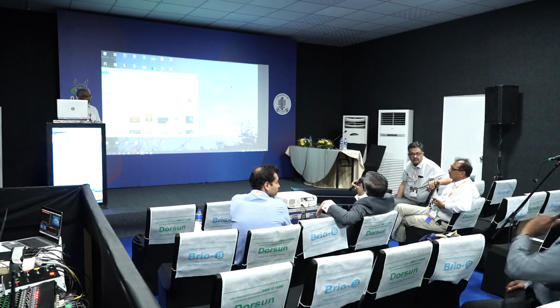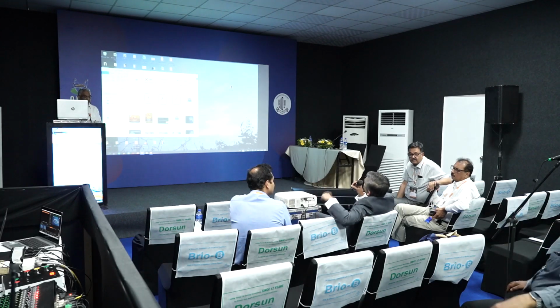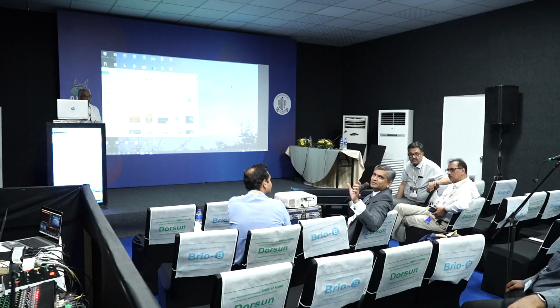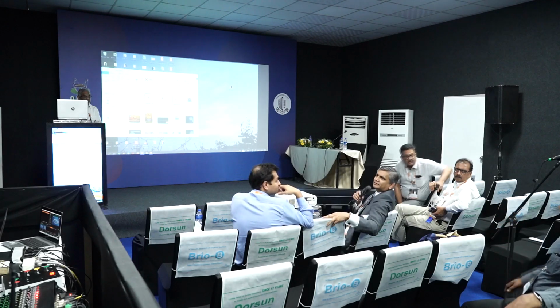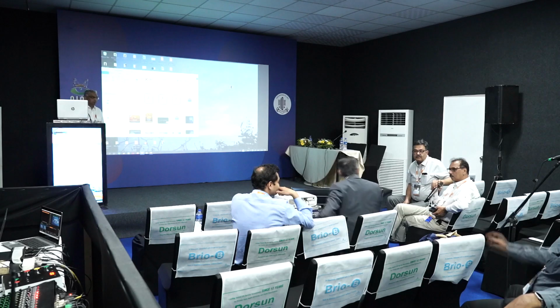In the cases where the pressures are not getting controlled, we tried doing an endo CPC. It will reduce the need for maximum glaucoma medication. So partial endo-CPC, maybe 180 degrees, is what our glaucoma specialist suggests. So I go ahead and do 180 degrees and leave it. Not much inflammation. It's not much.